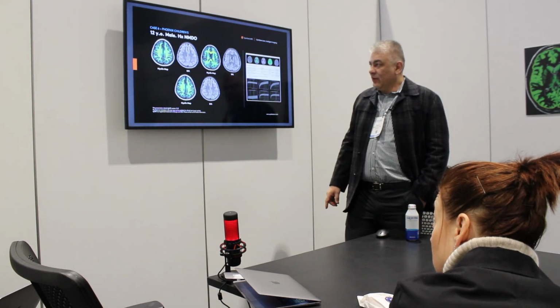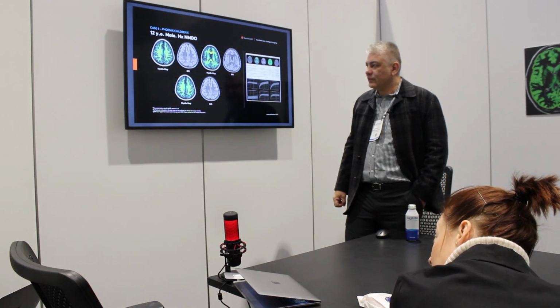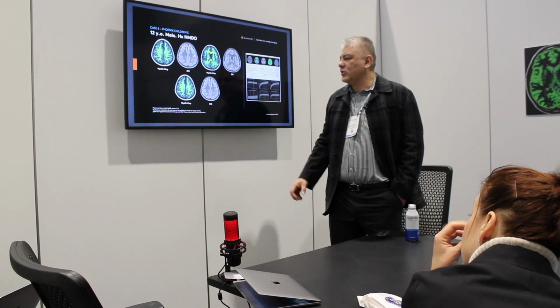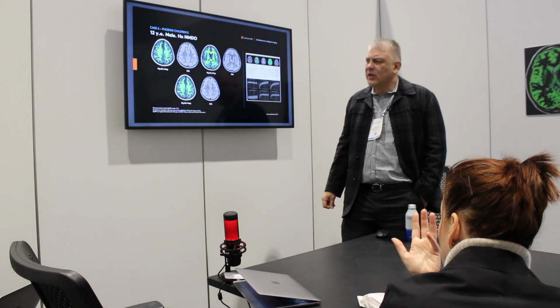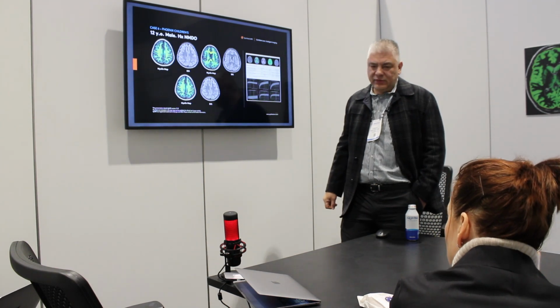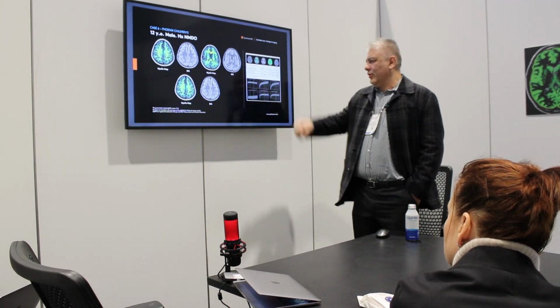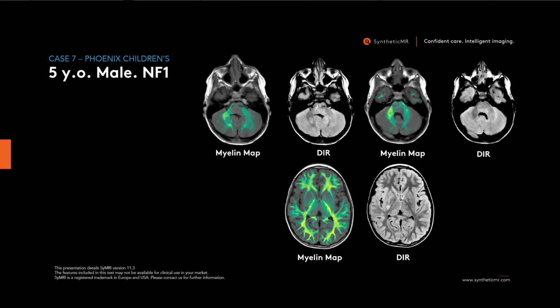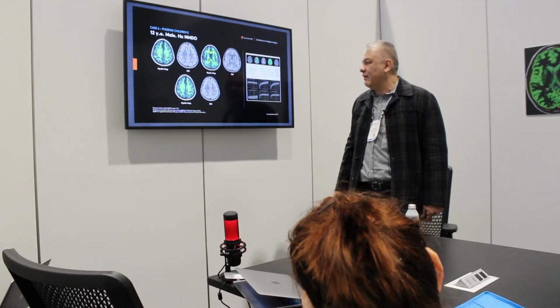And the subcortical qMRI, is that pathology or is that normal? Well, because it's pretty green, right? The subcortical lesions tend to be a little less, but this is more than they should be. Which is also, you know, you are 4 standard deviations below, so everything is low. But yes, the subcortical white matter can be a little low, but this is too low. But this is not just that, all the periventricular white matter should always be very yellow. And in this case, it's all green. So you can see that very, very easily.